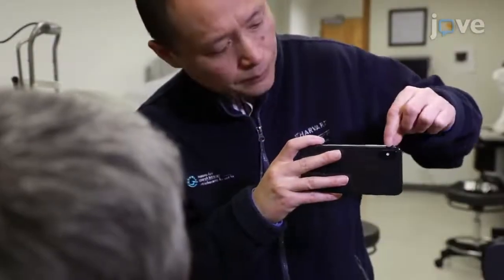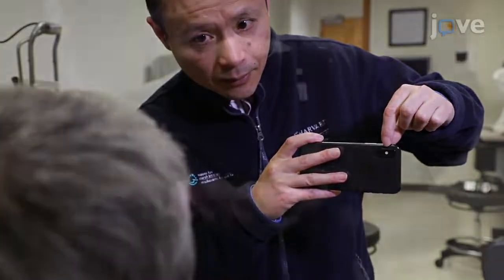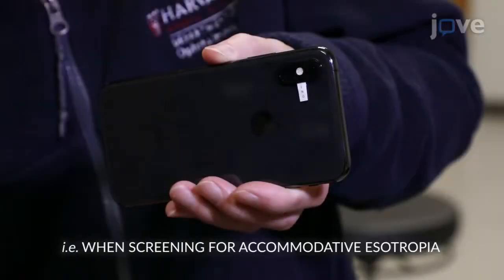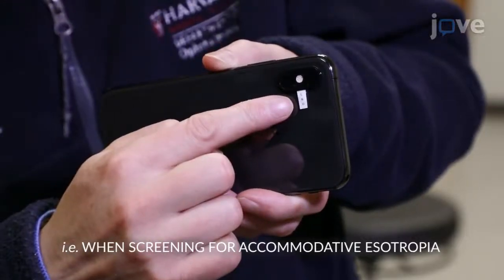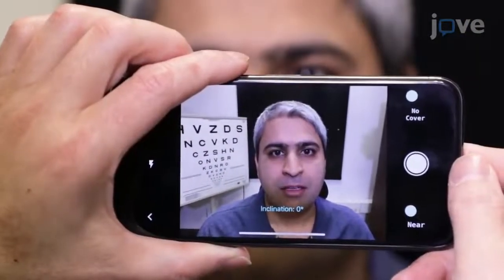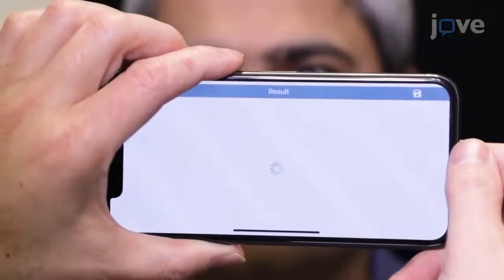Instruct the patient to fixate on the flashlight, which should be off at this point. For tests requiring a precise accommodation, paste a fixation target on the back of the phone directly below or above the flashlight. When the patient confirms they are fixating, press the round button to take a snapshot to be analyzed by the app.